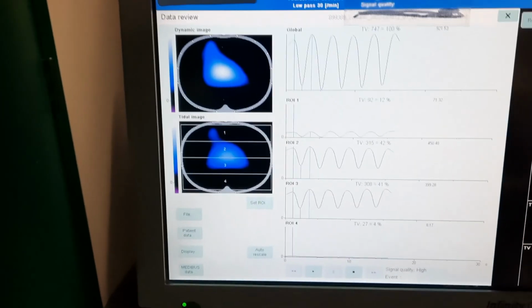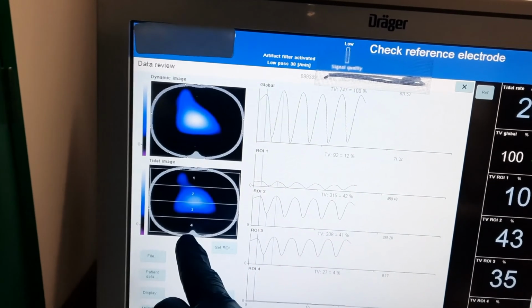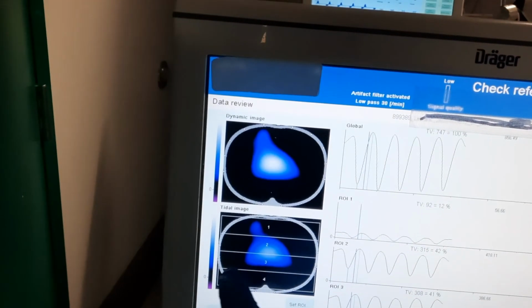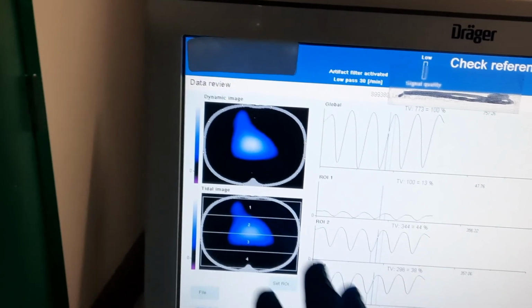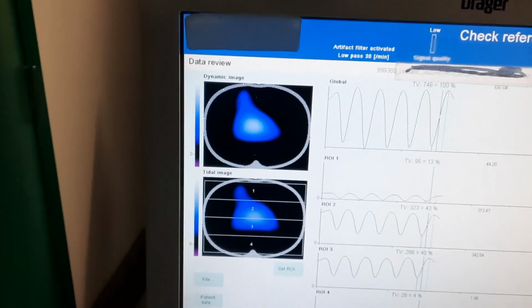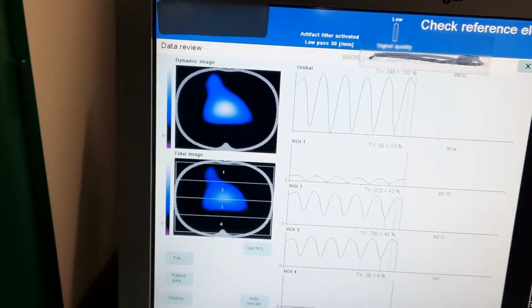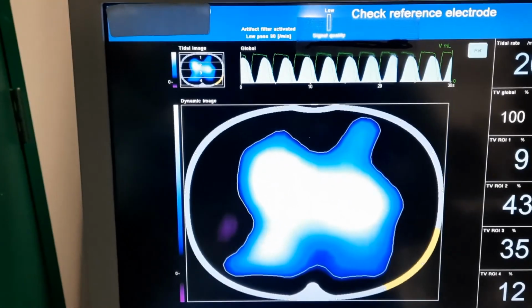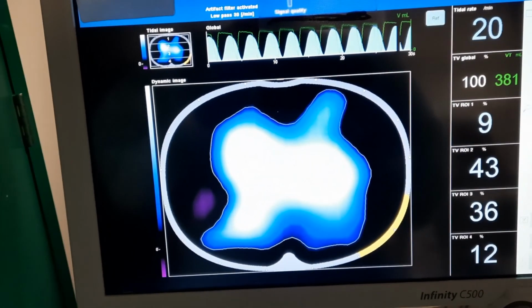This is yesterday, the 12th. This is what I was talking about, the distended abdomen and the extremely dilated colon. So we see that this is a patient when the patient's on a supine position, and you can see due to that increased pleural pressure a complete elimination of aeration at the dorsal region. So we decided to flip the patient at the end of the shift, and here we are this morning finally with this result. So very, very good result with the proning.